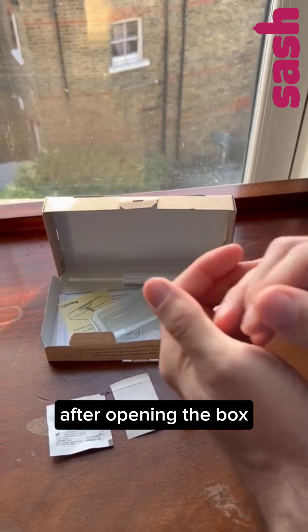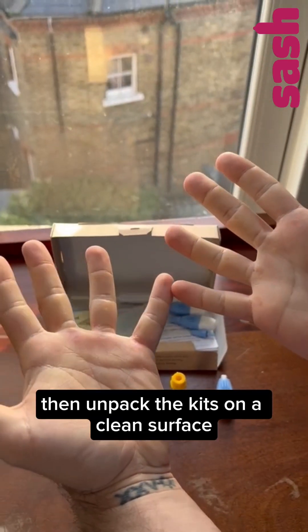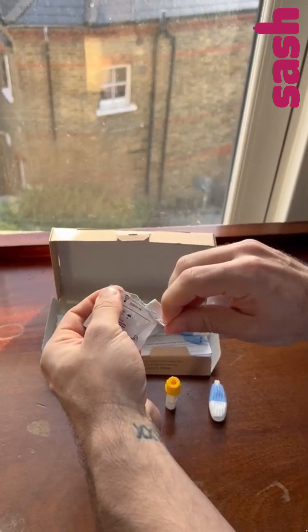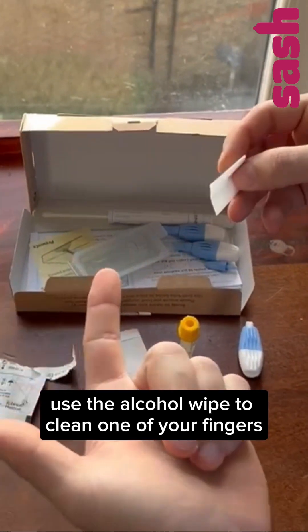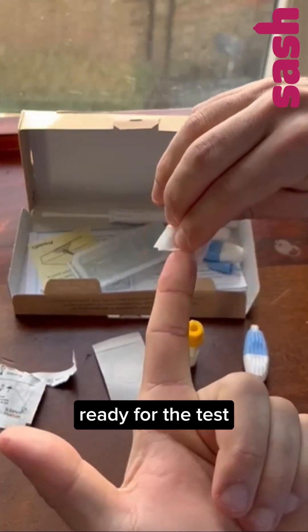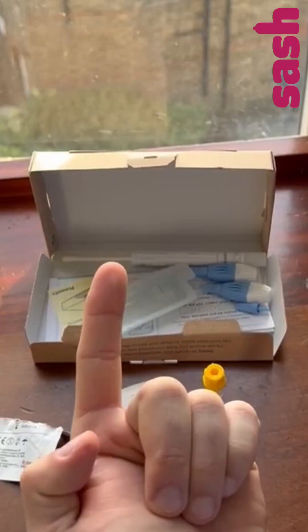After opening the box, wash your hands with warm water, then unpack the kit on a clean surface to ensure no foreign bacteria contaminates the test. Once that is done, use the alcohol wipe to clean one of your fingers. This ensures that your finger is clean and prepped, ready for the test. Once you're done with that, just let it dry.